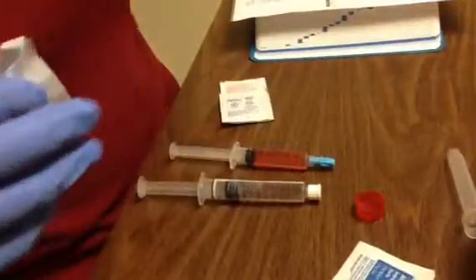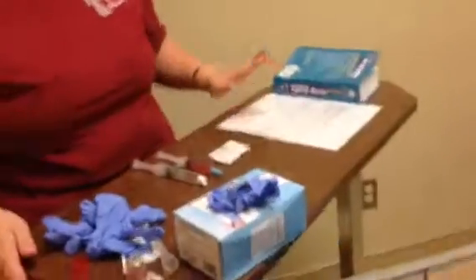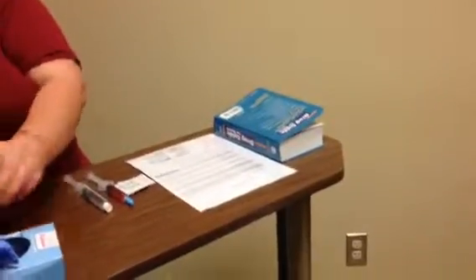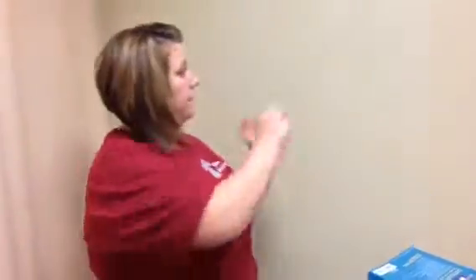We would dispose of this along with the syringe. Again, if it's a narcotic, make sure somebody watches you waste it. I'm going to go ahead and take my gloves off. Dispose of all this. Okay, now I'm ready to go into my client's room. I've got my MAR. I've got my medications. I have got alcohol preps, and I've got another pair of gloves. Okay.